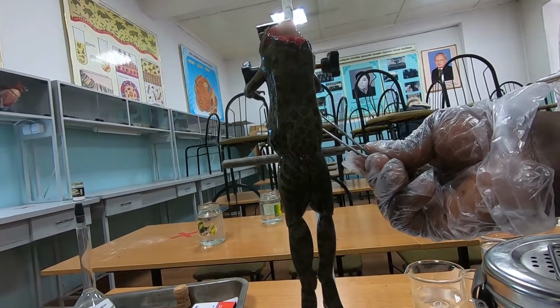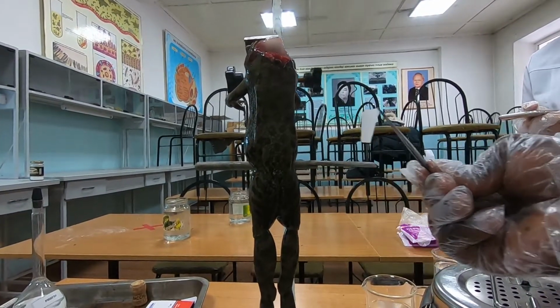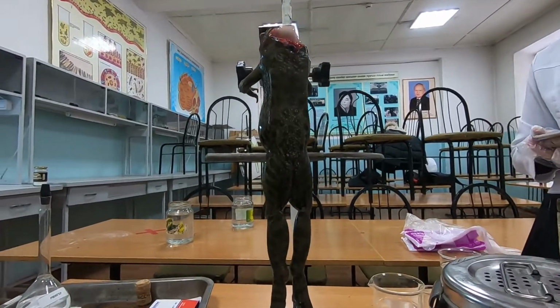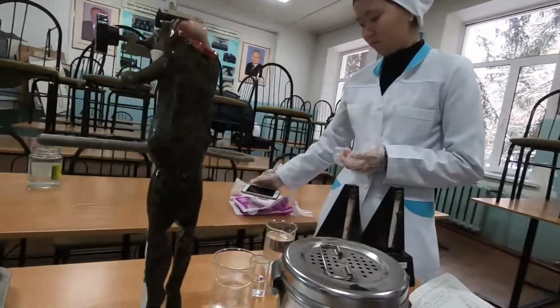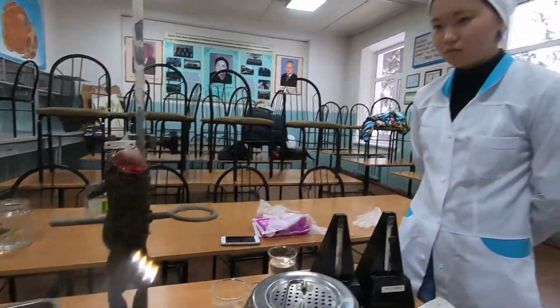So for it to get a quicker reflex reaction, we need a higher concentration, already not 1%. We need a higher percentage, maybe 2%, to have the same effect that we had during the application of 0.5%.